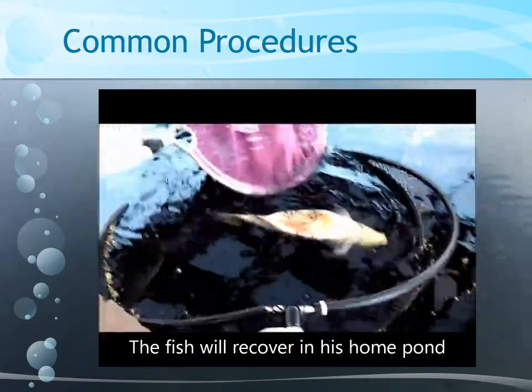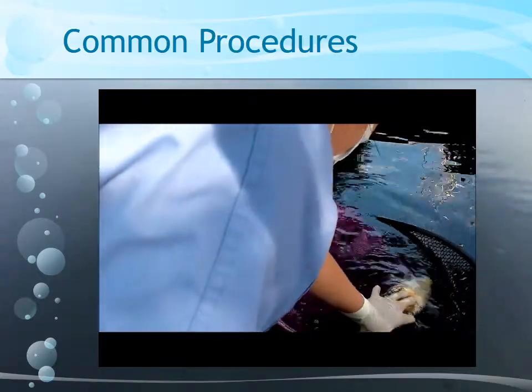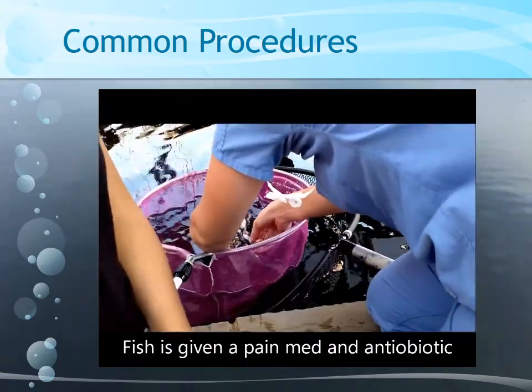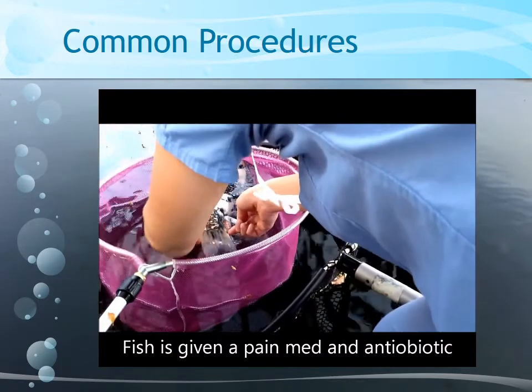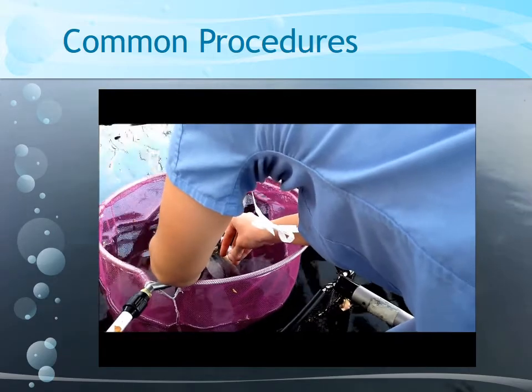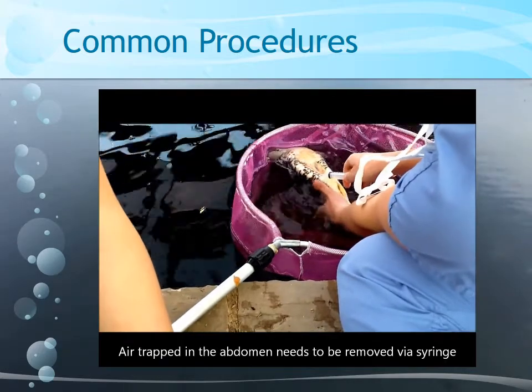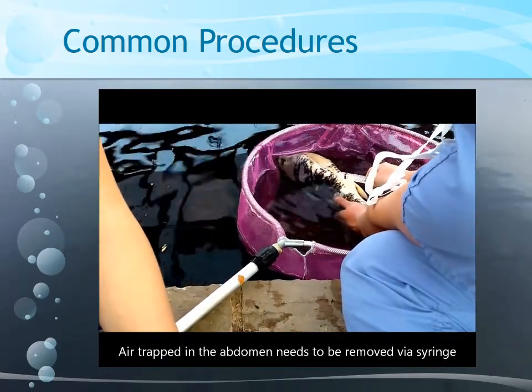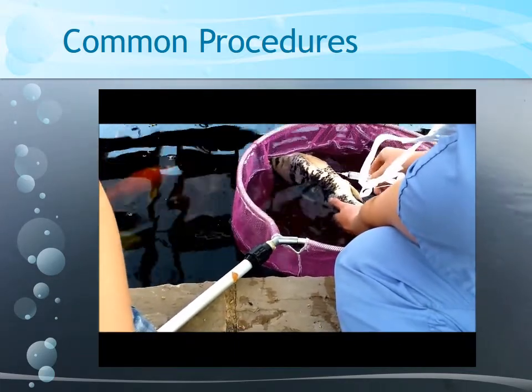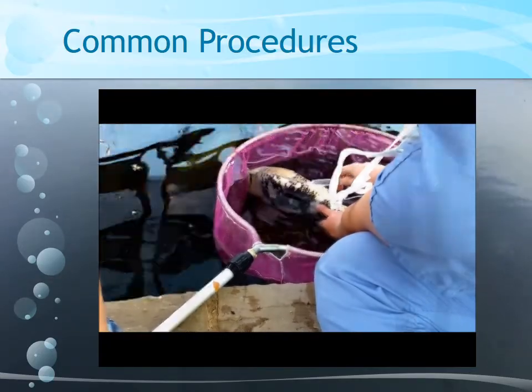I actually have to take some air out of him first. I'm just going to put this one for extra protection. I don't have to give him multiple shots. Sometimes he's full of air and can't really right himself properly. Yeah, I'm getting a bunch of air. So he just needs that syringe and pull it back out. Yeah, exactly. It's kind of hard to get out during surgery just because he's kind of gone concave on me.